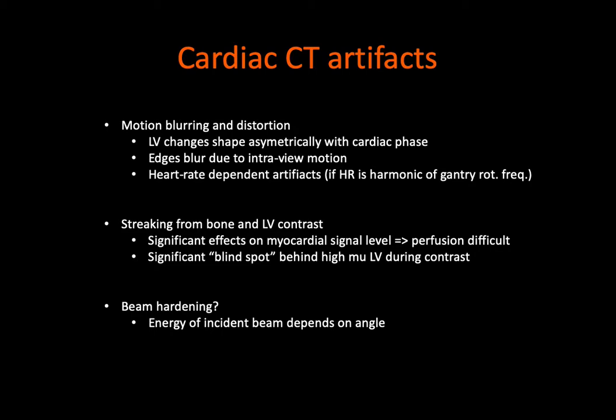So now the question is, what you're tracking is the intensity of the myocardium. What is the intensity value in Hounsfield units as it goes over time? And is that a robust measurement or not? Earlier we talked about the brightness of the coronary vessel, but we never really measured it. It's not that if it's 500, it's good, and if it's 489, it's bad, where you would have to measure that accurately. And there are a lot of things that can impact the intensity measurement of a piece of tissue.